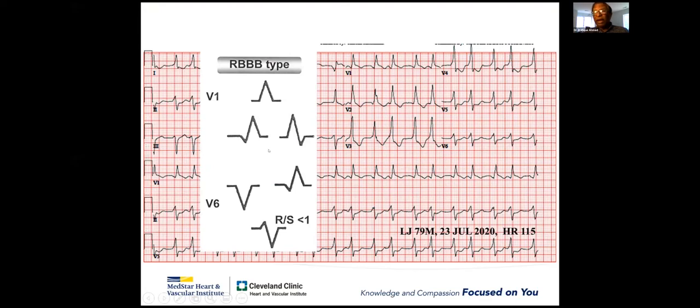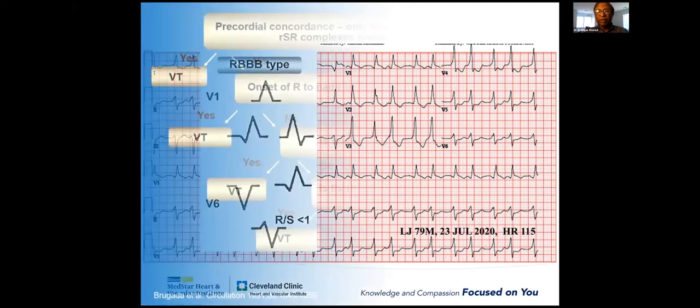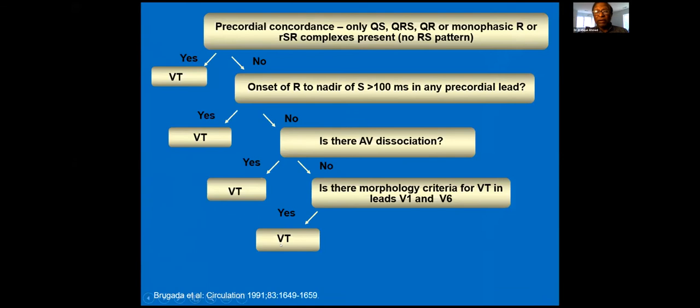So this patient actually had a VT, and I have confirmed it because the patient had a defibrillator, and when I did the intracardiac study on the same day, I could see the AV dissociation. So this is an unusual case. Now the question is, why is it irregular? That is the problem. So morphology criteria fulfilled, VT. I have two criteria fulfilled, and actually in other ECGs, I could see AV dissociation. So this is ventricular tachycardia.